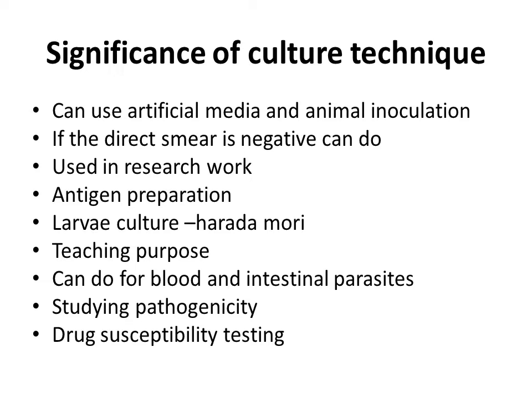The other important technique is culture techniques. Now you have to give the definition of the culture technique. The culture technique is used normally when the specimen is negative for the wet mount and the concentration technique. Why do we use the concentration technique? When the wet mount is negative, that means the specimen has a very low amount of parasitical stages. When we observe under wet mount, saline and iodine, it shows negative, but the patient still has symptoms.